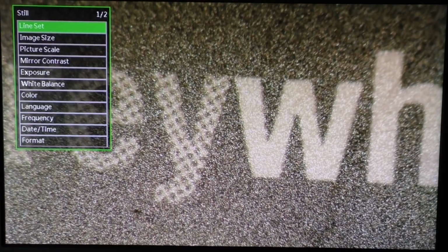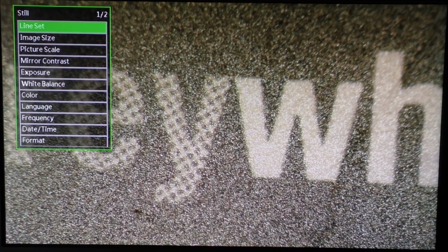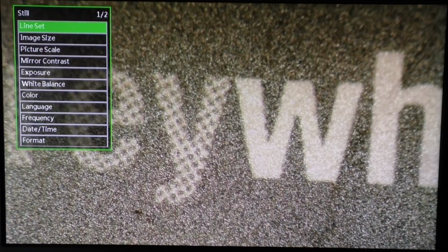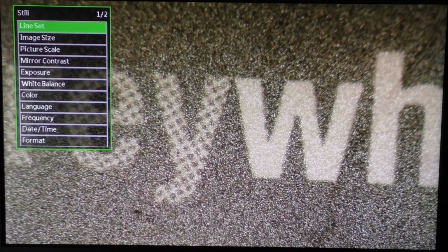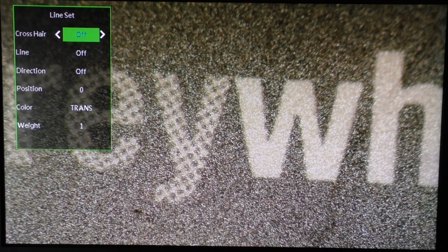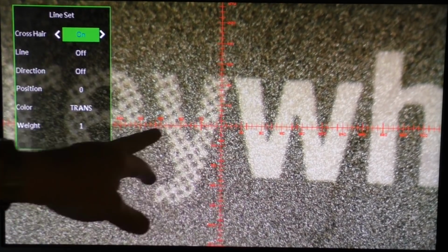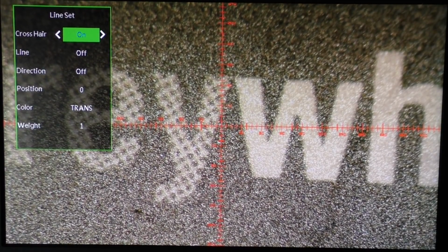Okay, so let's check the setup. There is a menu button and we are now in the still mode, as you can see right here. That's still video mode or photo mode. We have lines, and you know what? I can use the remote control. There is a crosshair setting with some more or less random numbers, because you can't say what scale it is because it depends on your microscope. Maybe it works if you use an original Hayear microscope.